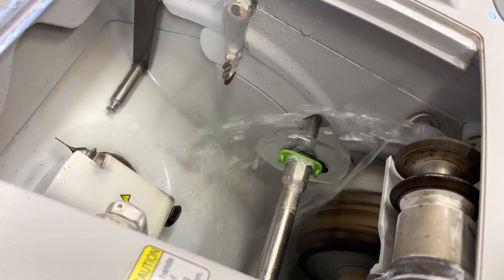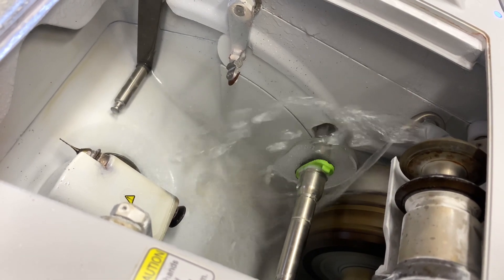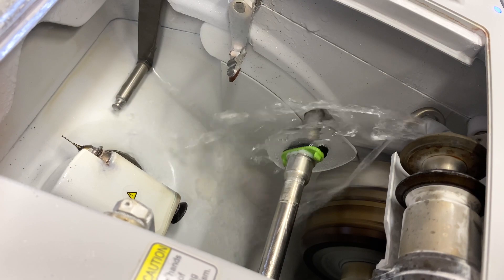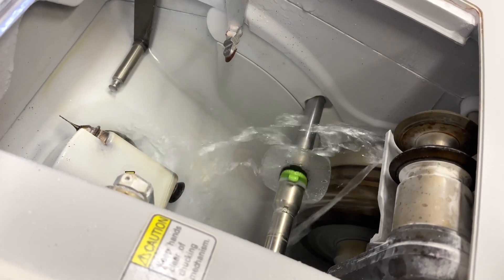After the first lens is finished, Sammy moves on to repeat the process for the second lens, ensuring all the edges are consistent.